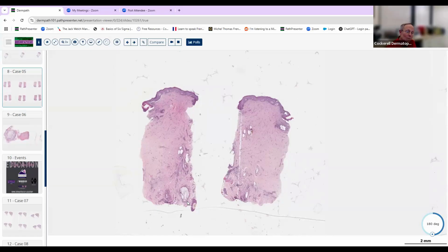It hits follicles and it gets areas between the follicles. Is the epidermis involved also, or is it just only hitting the follicles? What kind of cells are they? Are they lymphocytes mostly? Are they neutrophils mostly? Are there some eosinophils infiltrate, like we sometimes see, for example, with alopecia areata?